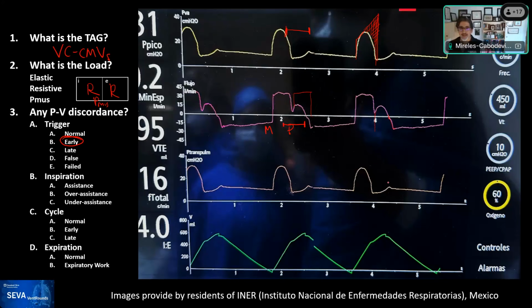Rob? Megan says the trigger threshold must be high. That's just what she said. Sensitivity is low, threshold is high. Correct.